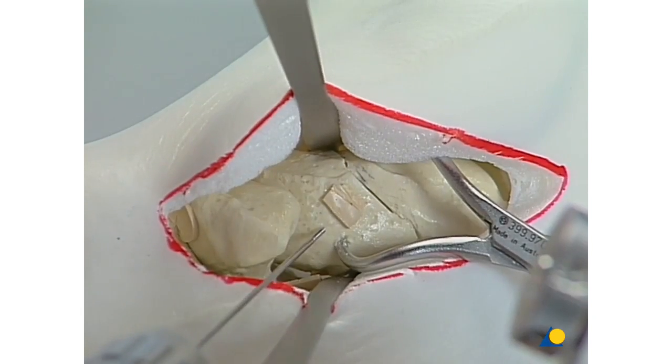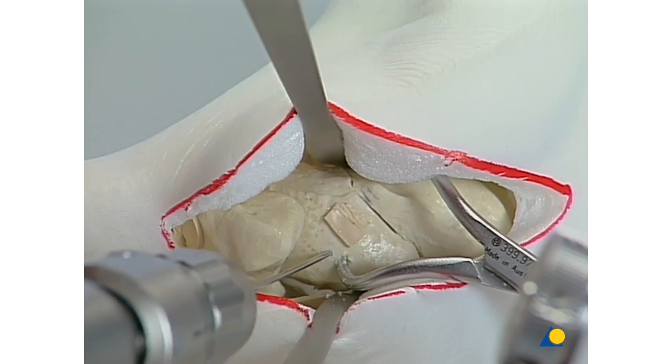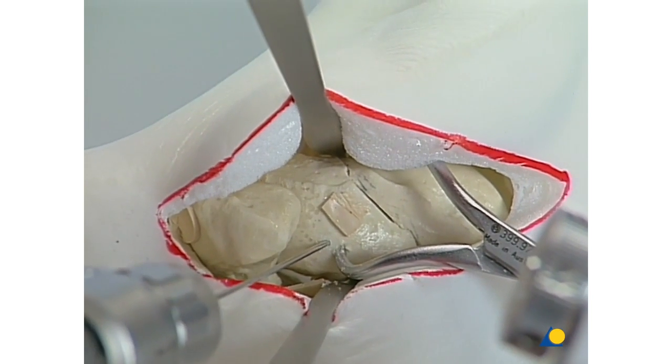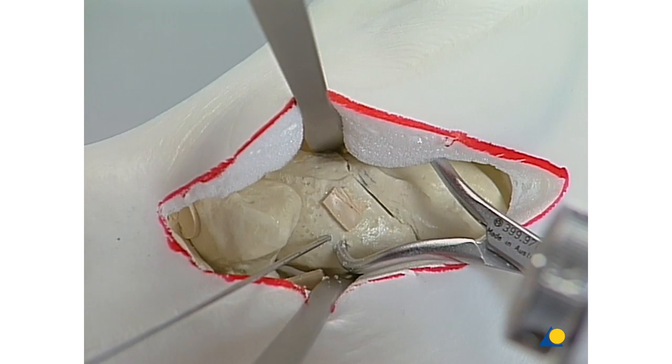After reduction of the fracture on the medial aspect of the bone, fixation of the fracture is obtained using the threaded 1.6mm K wire. After this fixation the leg is rotated.